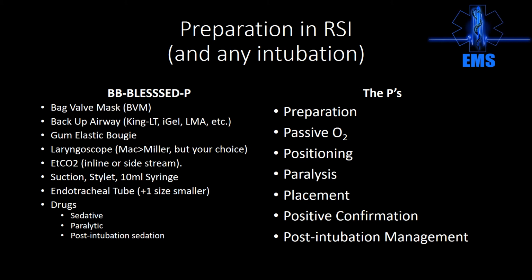Drugs, in this order: sedative, paralytic, and post-intubation sedation. So before you tube the patient, pull up the post-intubation sedation because you're going to forget. Every time somebody drops the tube, there's a high five moment with the whole crew, and then the patient starts bucking because nobody remembered to give the patient the Versed or the ketamine after we intubated the patient. And now the patient is totally alert and aware of what's going on and has a piece of plastic between their cords. That's a party foul. That's points that are deducted for style. So draw them up before.